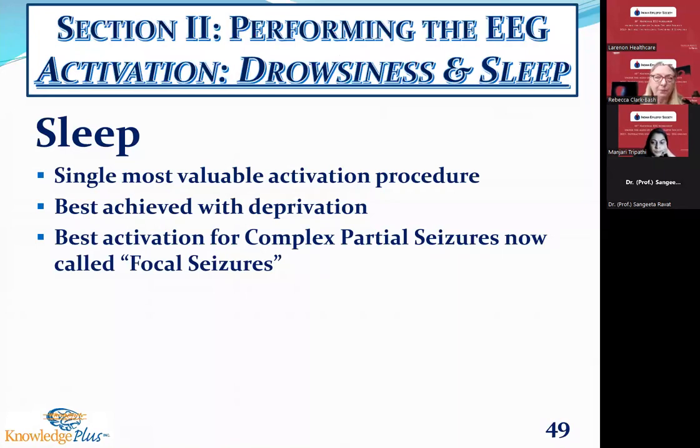And I'm not going to go through every sleep pattern, but I want to talk about them so that you understand how deep my patient has to get into sleep to be an advantage to just ruling out or determining a seizure type, seizure classification, and secondarily treatment. So in this example, it says here, it's best achieved with deprivation. I can't stress that enough.